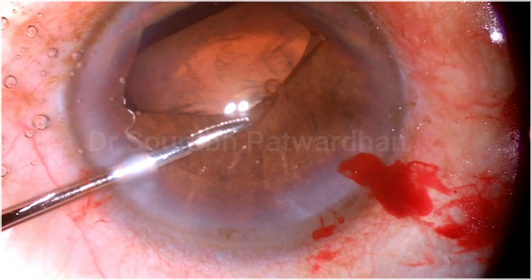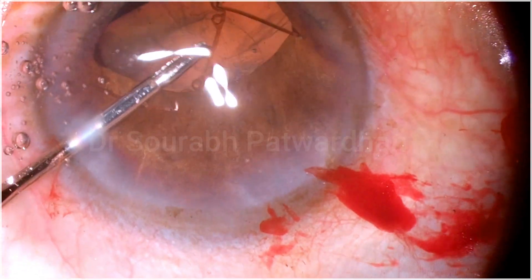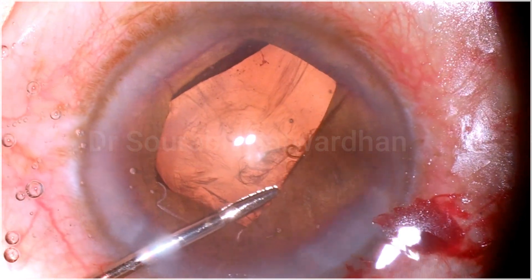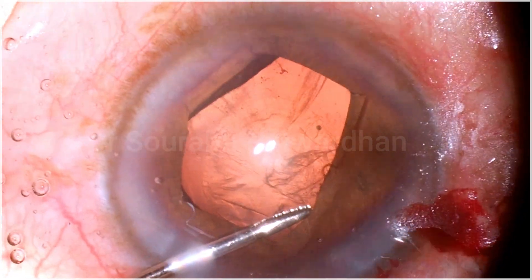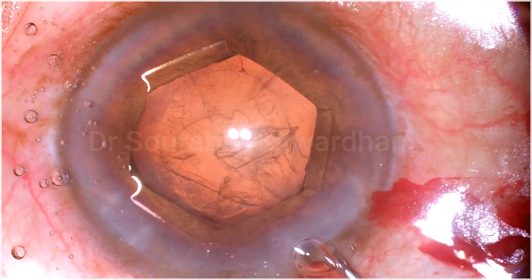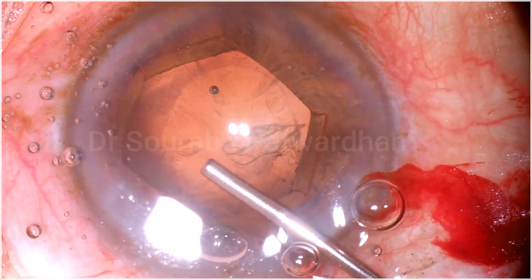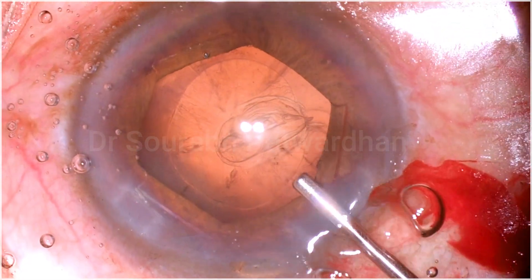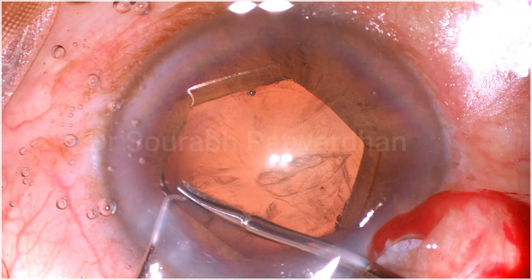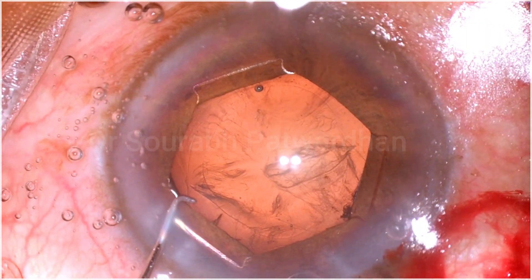I generally use only one side port. This is how I tuck the third flange under the iris. I prefer to do this because then the flange of the B-Hex under the incision is below the iris, so when I insert the IOL, it doesn't drag the B-Hex ring with it. You can see the CCC is complete but it's small, so obviously I don't want to go ahead with a small CCC — I want it at least 5 mm.